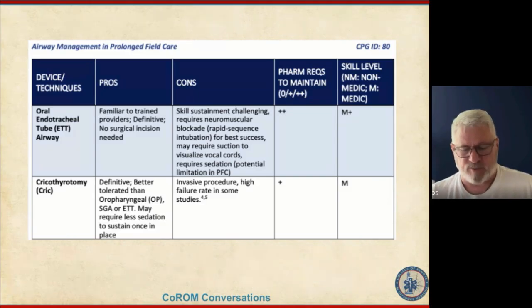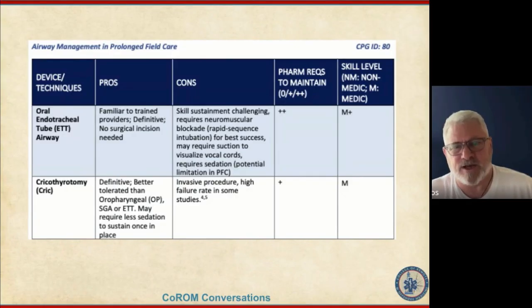You can grab the practice tubes and use the tape to cover, to do those very low cost simulated surgical airways, or you could go get goat tracheas or pig tracheas and go through the process on more pseudo live tissue, and then actually carry out into live tissue training where you're doing it with sedated simulated patients. That's where you scale it off. It gets very expensive if you're using the simulated patients, because you really only get one good crike. The rest is kind of sloppy thirds, fourths, 15ths, depending on how many medics you have training. So that's a place where mental rehearsal could be beneficial when you have a large group, or just individually, trying to make sure that you get to skill mastery.